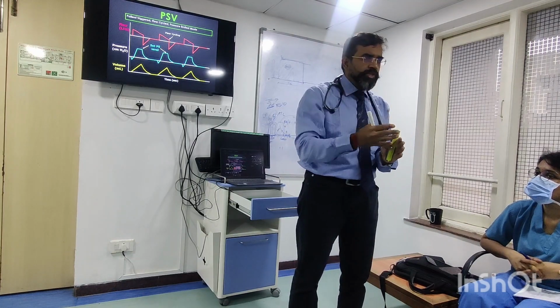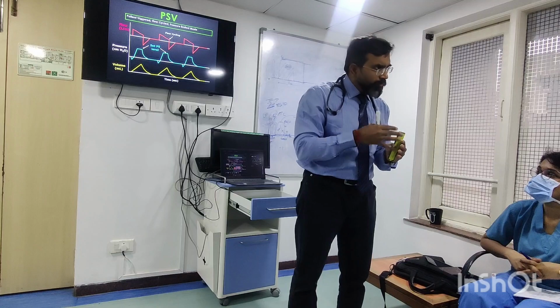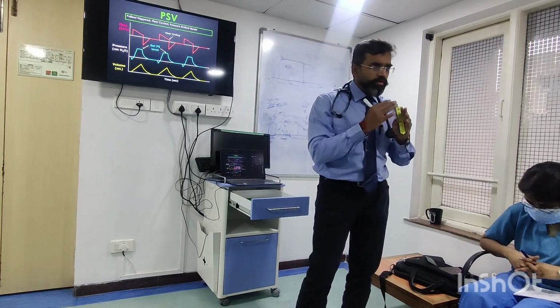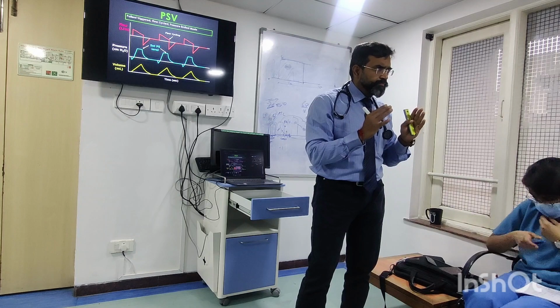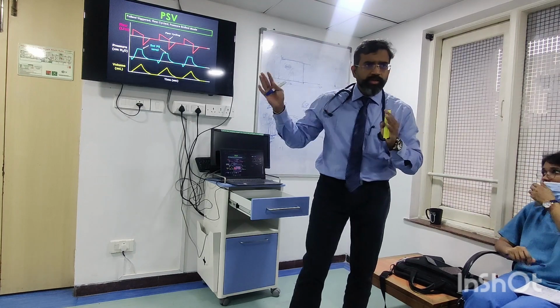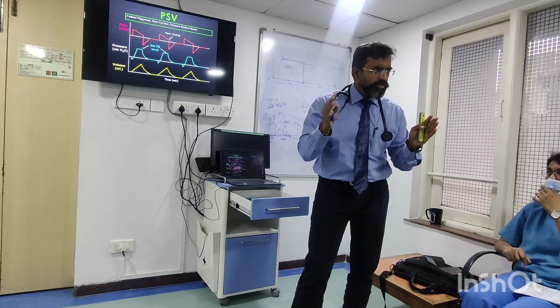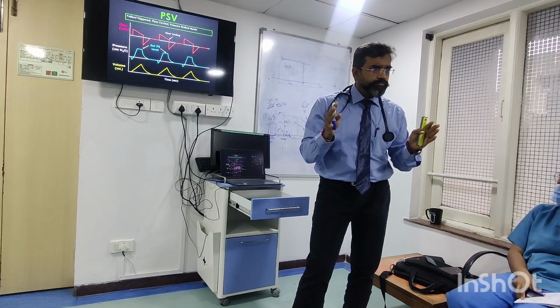Otherwise you make this mistake. "I put the patient on BiPAP." BiPAP is a pressure controlled breath. It is not NIV. BiPAP is a pressure controlled breath. So drop that terminology. Our terminology here will be pressure supported breath, where trigger is patient, limit is pressure, and cycle is flow.